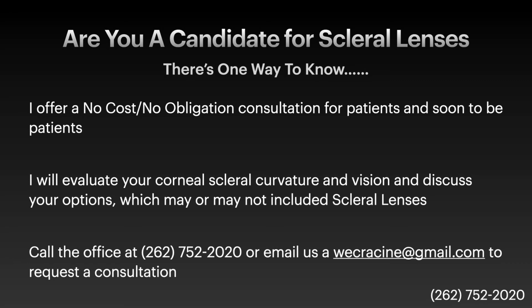We'll take a couple of measurements and talk with the patient and determine if this is even an option for them. If it is, then we can discuss what we need to do as far as the process, and then actually get into the actual designing of the lenses. If you're an existing patient who's up to date on your eye care, we can just go ahead and start doing this process. If you're a patient who hasn't had a recent comprehensive eye exam, we will start with an eye exam to make sure everything else in the eye is healthy and we aren't just dealing with one issue when there's multiple.